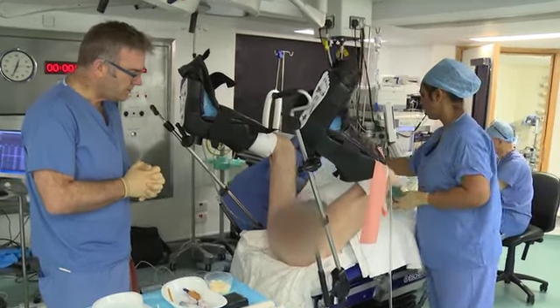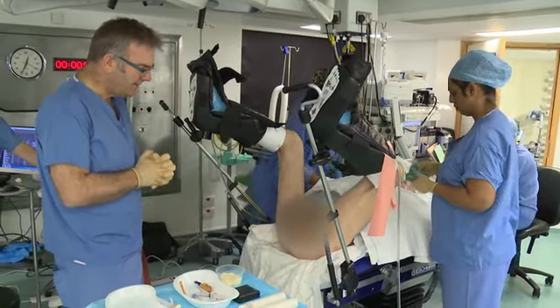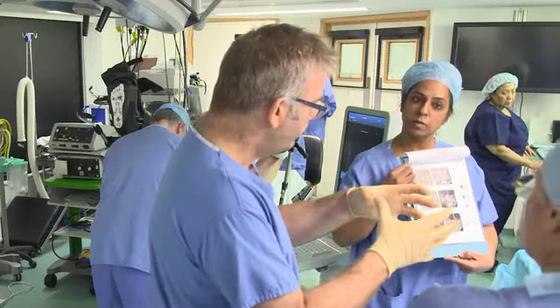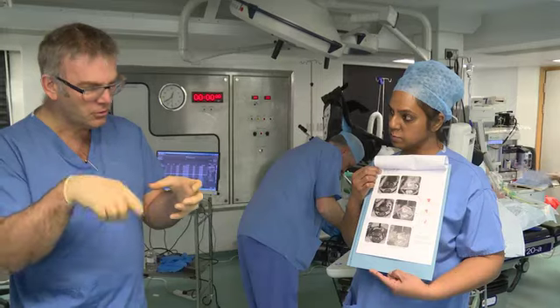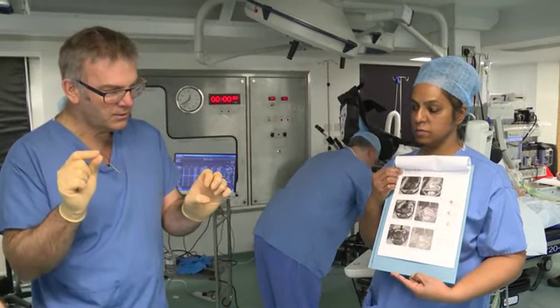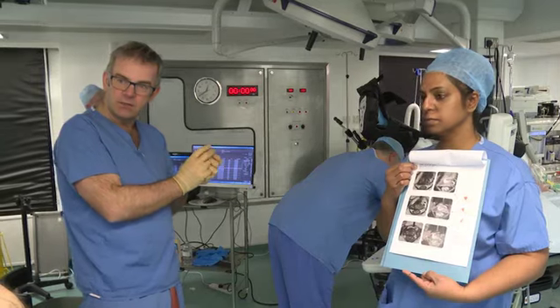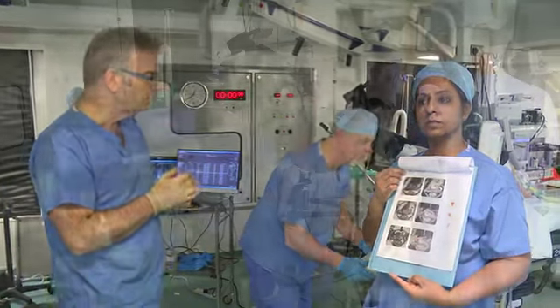We're going to use the MIMSoft software to see if that can improve our accuracy of getting to this difficult part of the gland, which is just to the right of the midline anteriorly. So what we're going to do is superimpose the MRI information, which is being captured by contouring the prostate, contouring the tumor, contouring the seminal vesicles as visual fiducial markers, and contouring the urethra. So we've got a skeleton of the prostate that we're going to superimpose in real time on the ultrasound images to help me get the needles into that position.